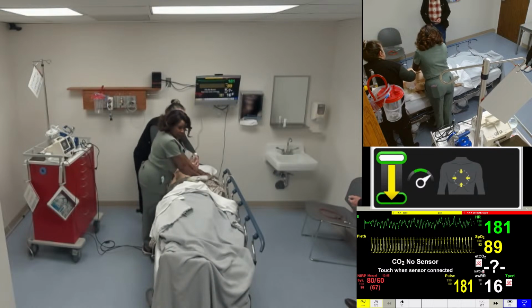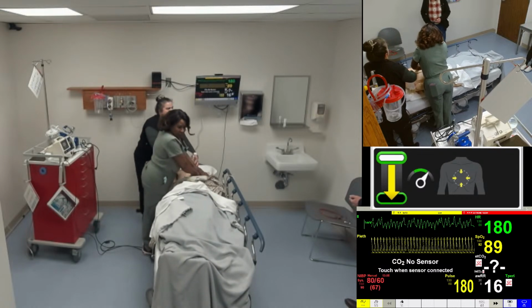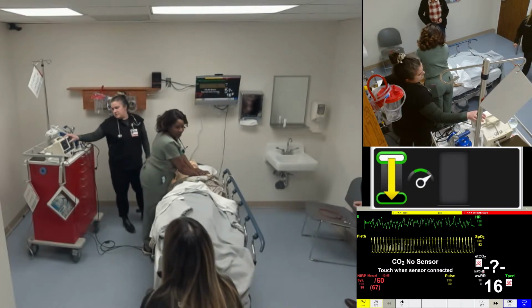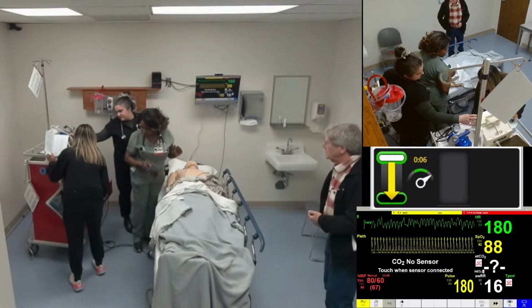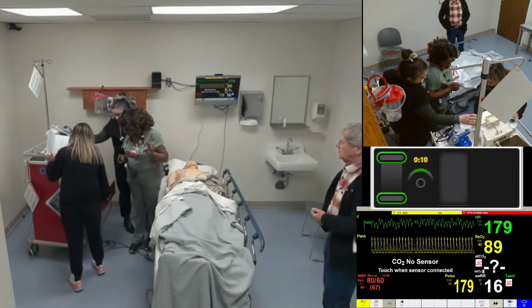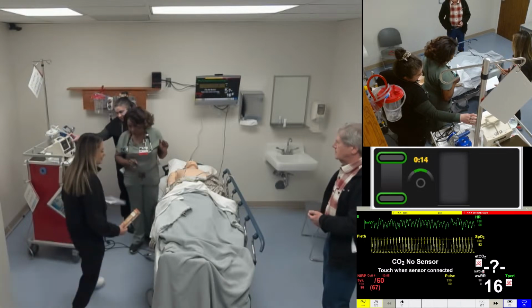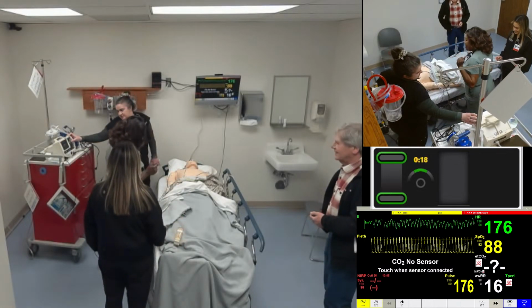Any medications that you would like to give the patient? Amiodarone or epinephrine. Why amiodarone? Okay, how much epinephrine would you like to give the patient? Wait, stand back. How much of that? 0.5. 1 milligram you mean? Okay. Wait, stand back. Stand clear. Push to shock.